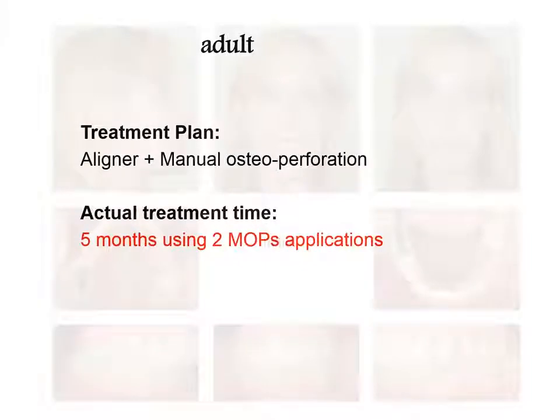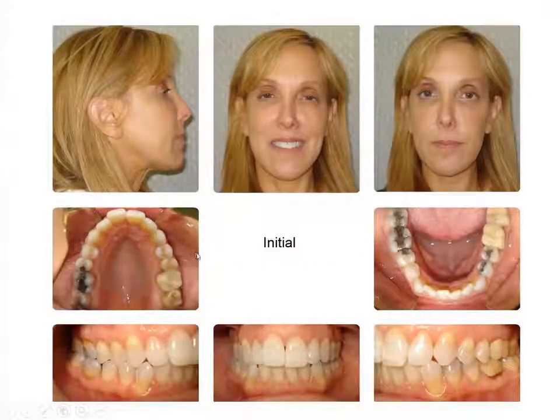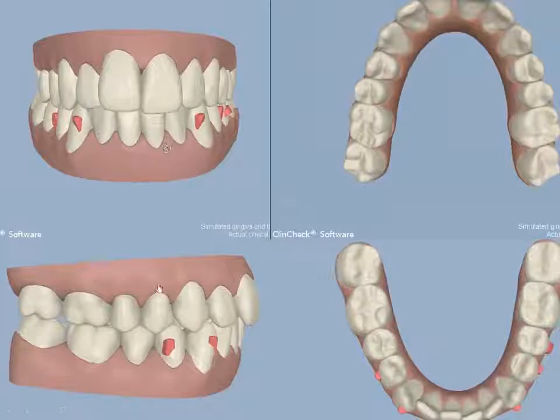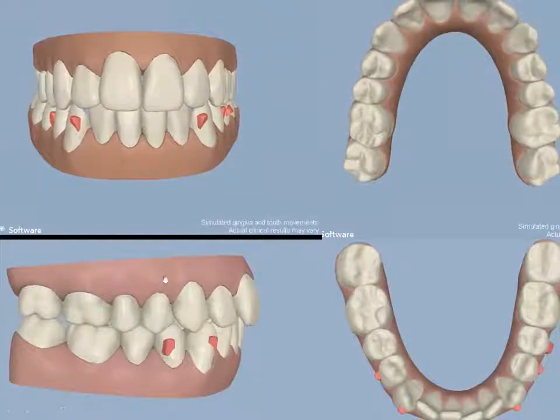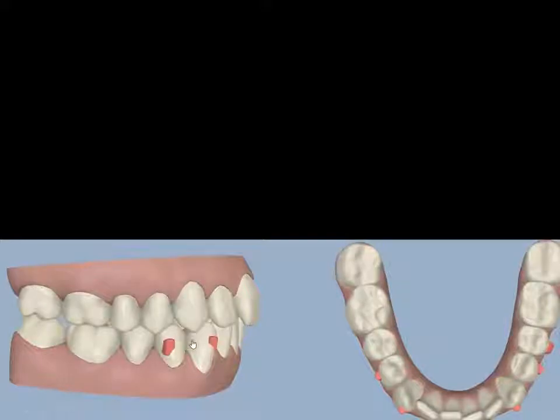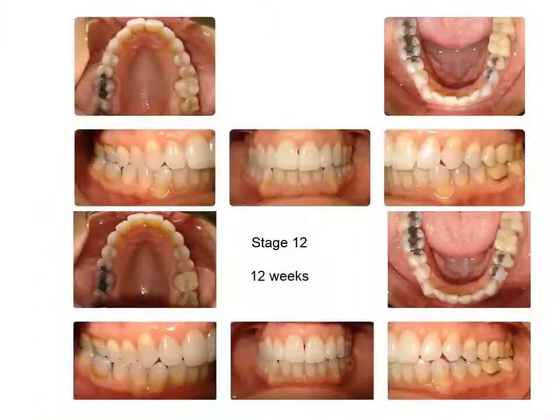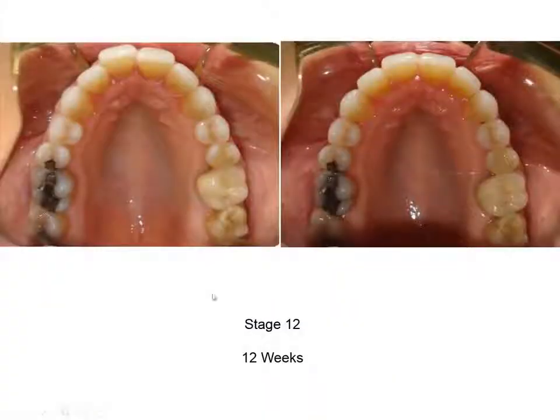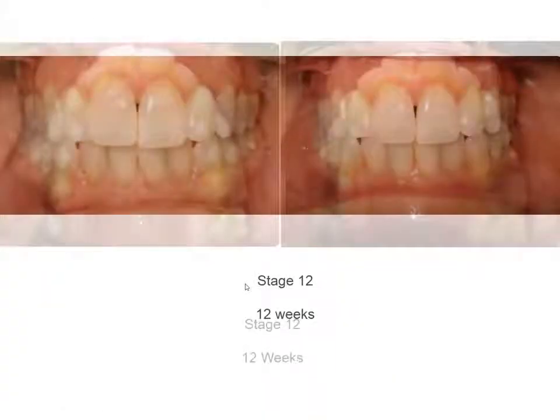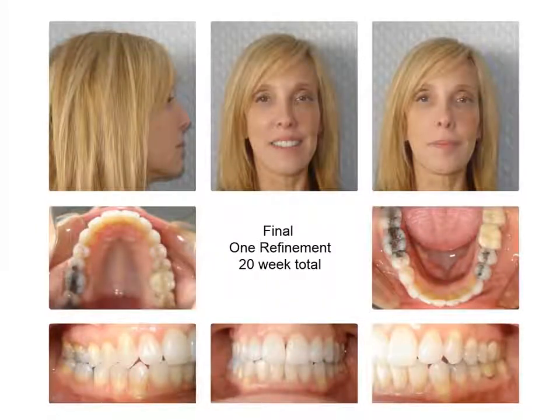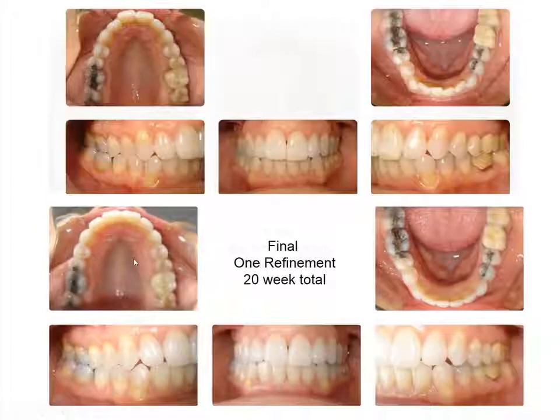Next case treated in five months — coming in before her wedding for minor corrections. Old plastic. One perforation mesial four to four top and bottom, through all aligners in 20 weeks with one refinement, broadening the arch as much as possible.